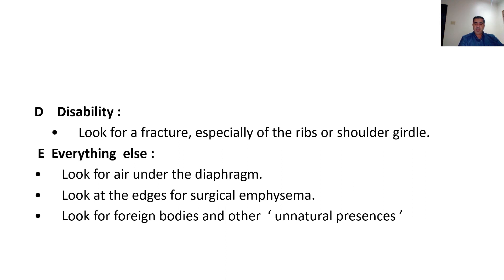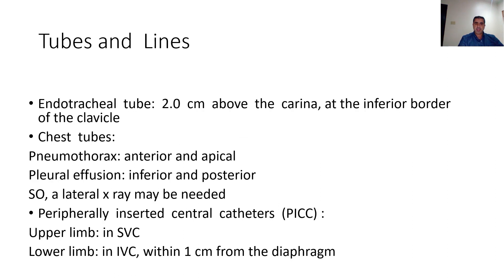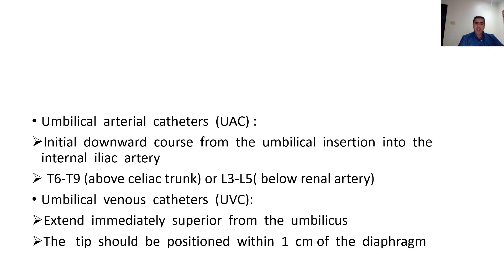After completing the ABCDE system, it's important to look for tubes and lines. The tracheal tube should end two centimeters above the carina and the inferior border of the clavicle. For chest tubes inserted for pneumothorax, they should be anterior and apical; for pleural effusion, they should be inferior and posterior — a lateral X-ray may be needed to confirm position. PICC lines inserted from the upper limb should be in the superior vena cava; if inserted from the lower limb, they should lie in the inferior vena cava within one centimeter from the diaphragm.